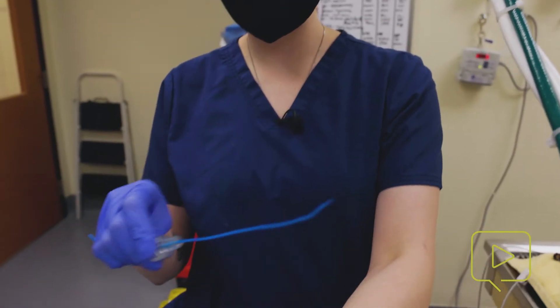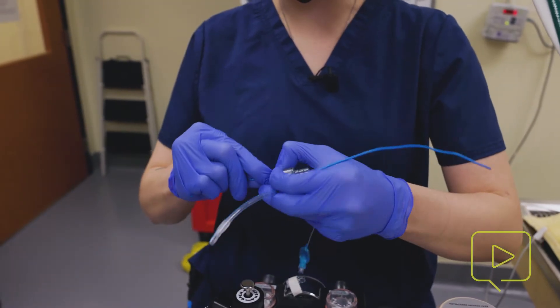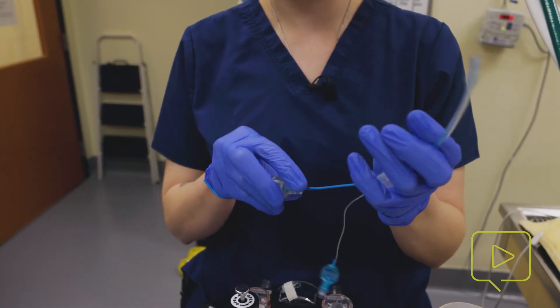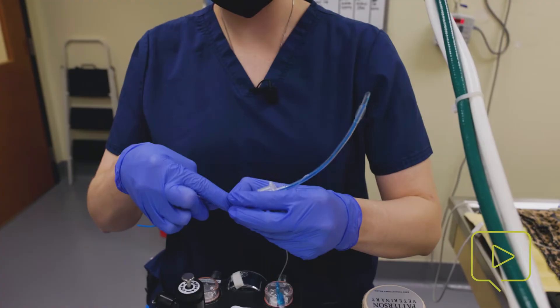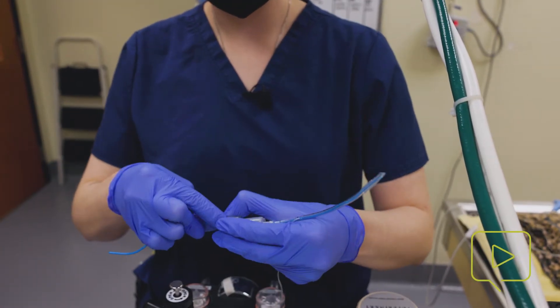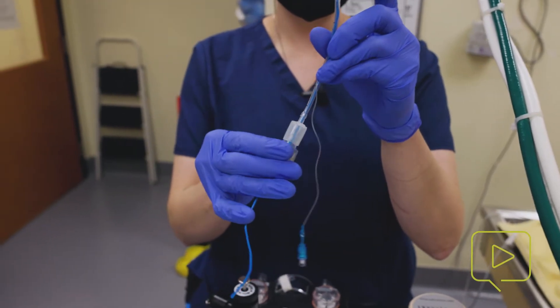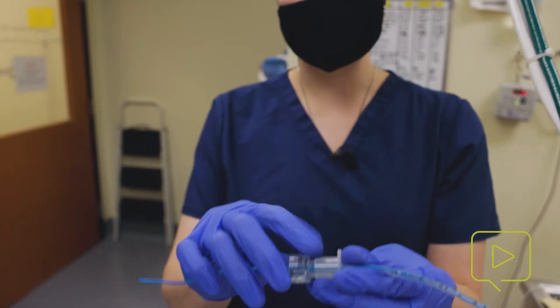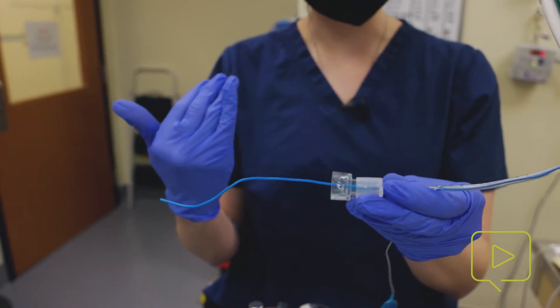These stylets also come with a stopper to help minimize movement of the stylet in and out of the ET tube. You can just slide this down until it fits into the adapter on your ET tube. Again, we're not covering this hole, it's not extending past the ET tube itself, and it's nice and seated so that your stylet won't move on you while you're attempting to do placement.